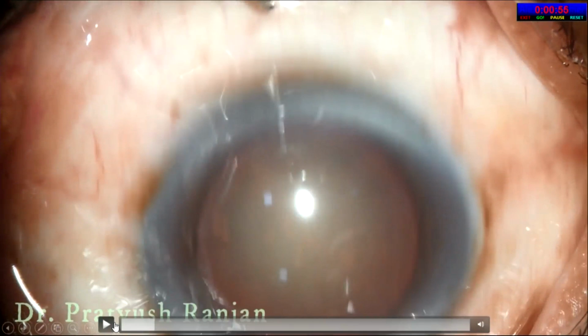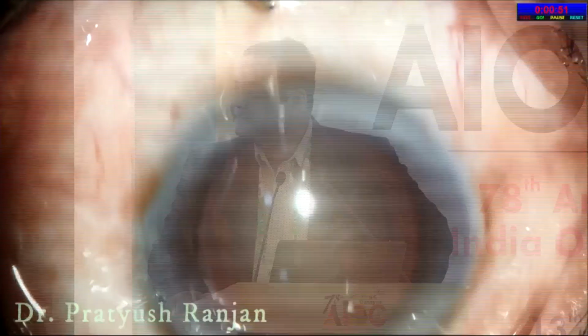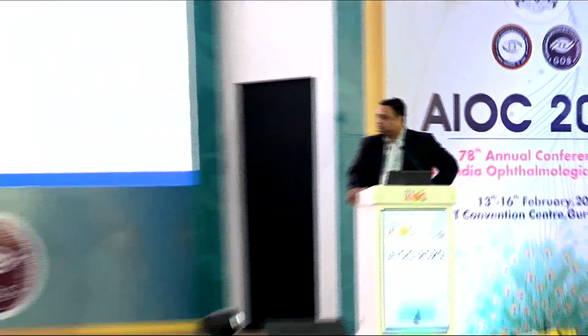This is a marker you designed well. I tried it, you know, but the only thing is, I think it is a very good idea to have a transconjunctival incision, going to sclera and then tunnel making. I think then you save a lot of conjunctiva and you save a lot of stem cells. But conjunctiva clean cutting in old people is difficult. Yes, sir. That straight line cutting of a conjunctiva in an old person, because there is a lot of looseness, and making it a straight cut through your marker also, sir, I find it difficult sometimes.